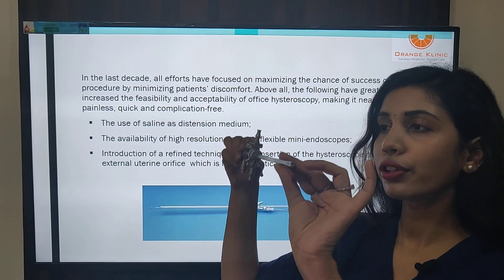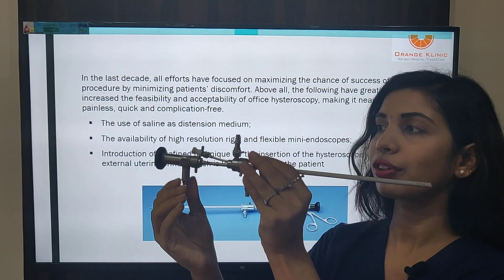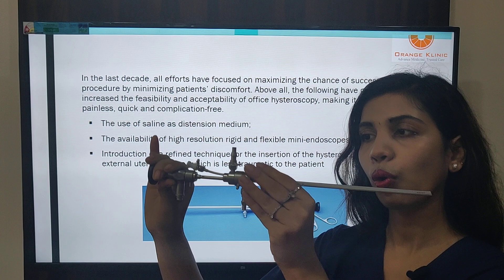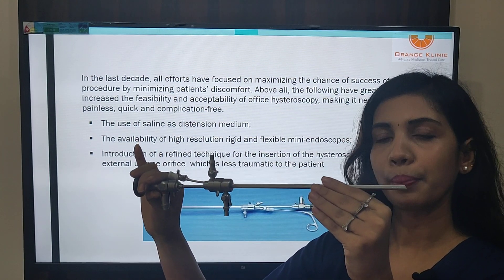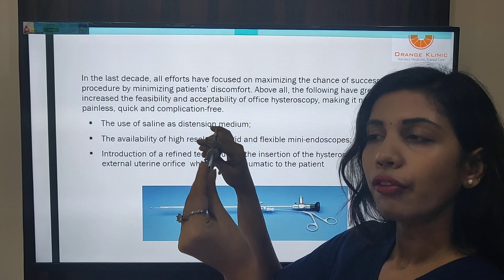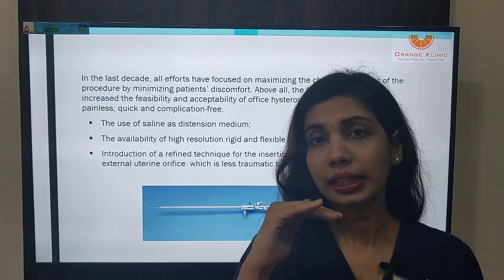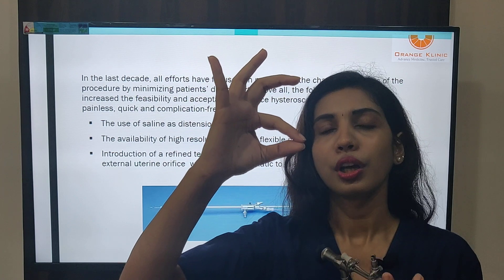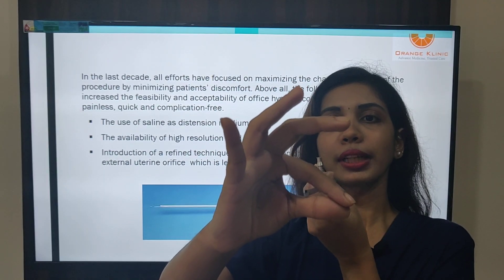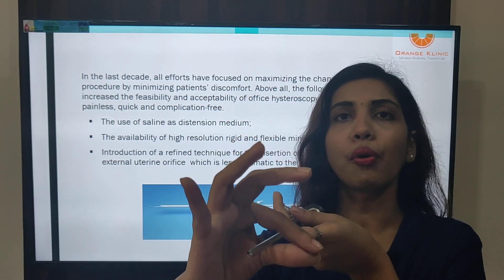For example, this is an office Bitochi hysteroscope. This is the inflow sheath. This is for the light cable. The scope is connected here. This is the operative channel. This is a 2.9 mm scope with a total diameter of around 5 mm. The end of the scope has been specifically designed for office hysteroscopy — it is vertically oval, and since the isthmus is transversely oval, when we are at the level of the internal os, this scope can be rotated 90 degrees to align itself with the isthmus and pass through easily.